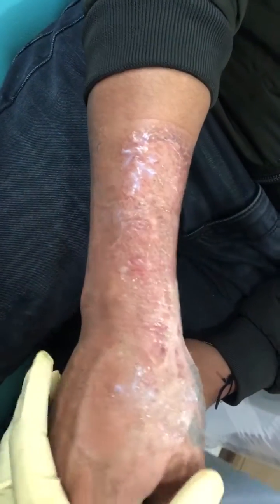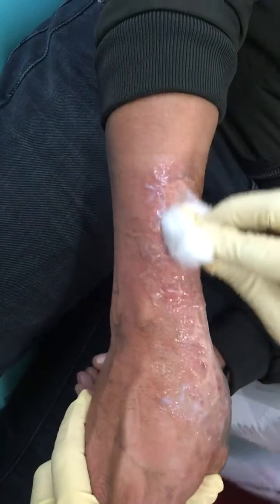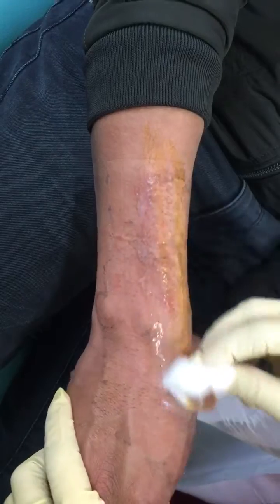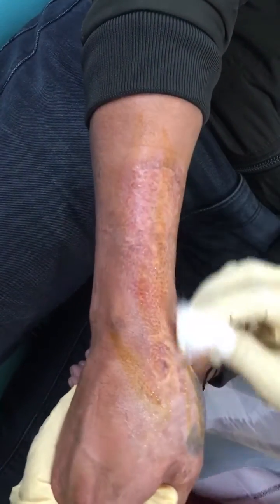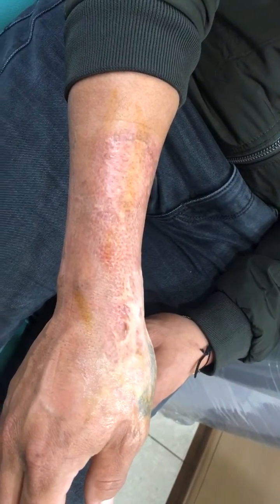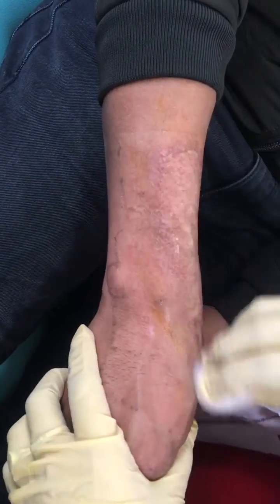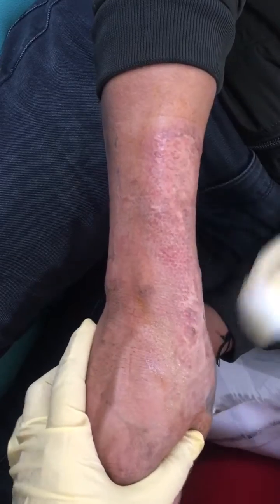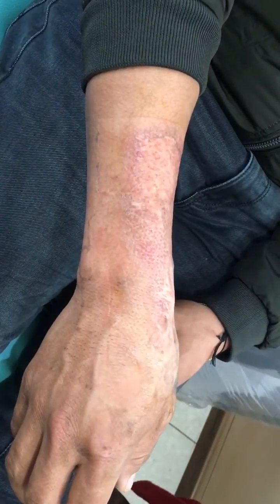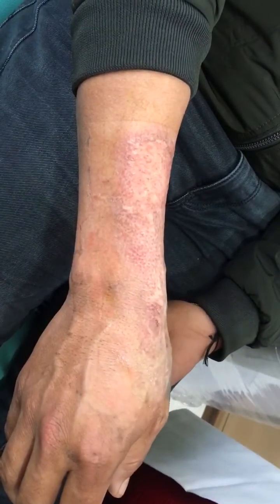So today for treating this scar we will do the mesotherapy, followed by CO2 laser. We are cleaning the area first, and then we will do mesotherapy for the scars.